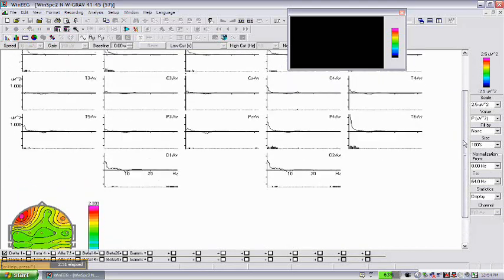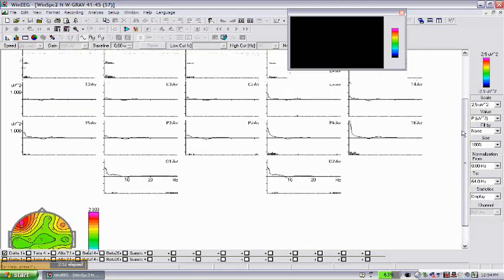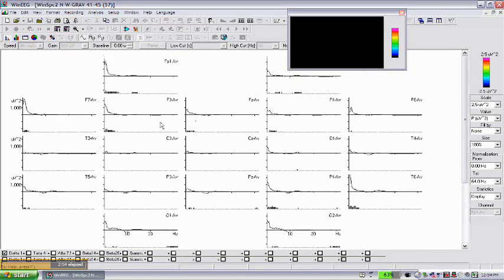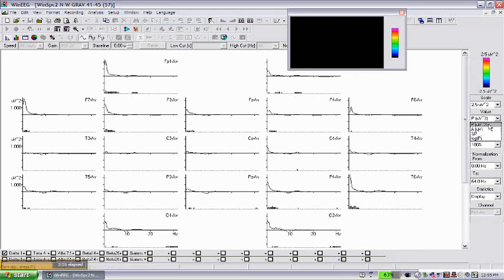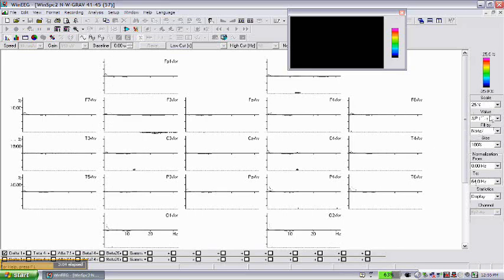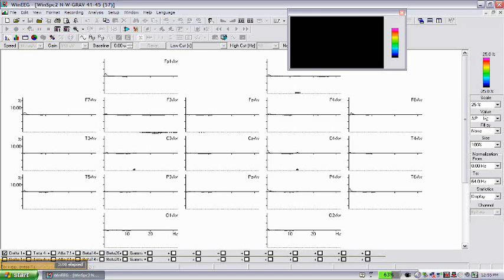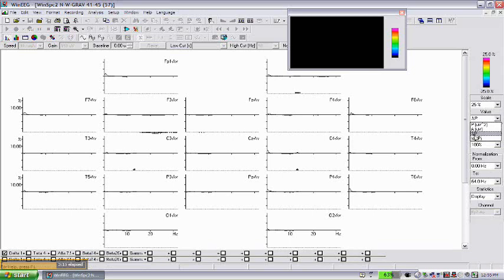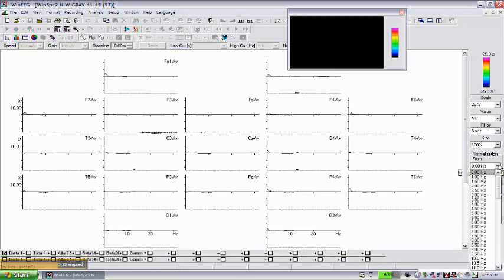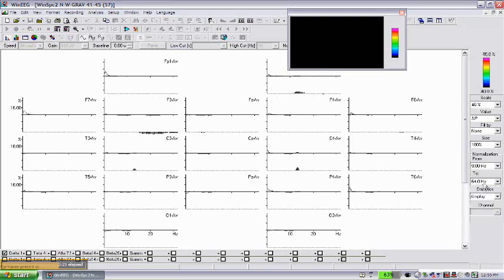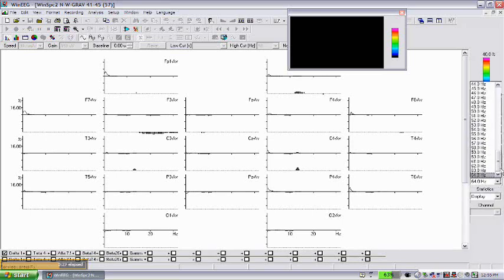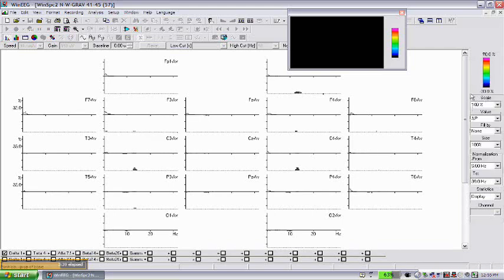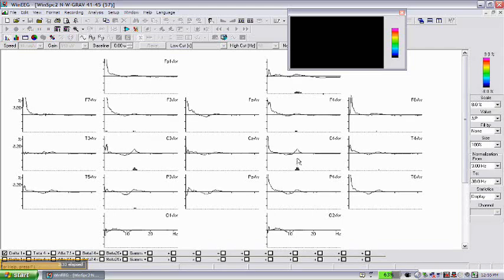We can map this activity, so mostly this slow activity is at the left side frontally. We can do this comparison in absolute power, we can do it in amplitude, and we can do it in relative power. To make comparison in relative power, just simply click on value, select this option, percent P, and I usually normalize the spectra.